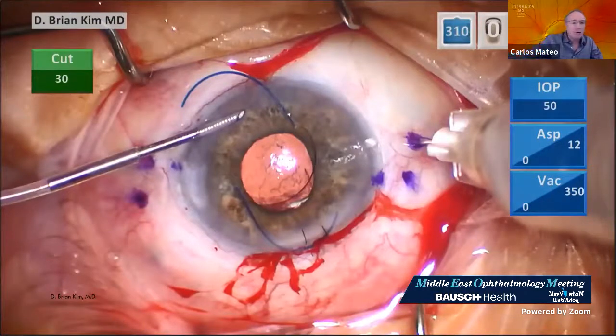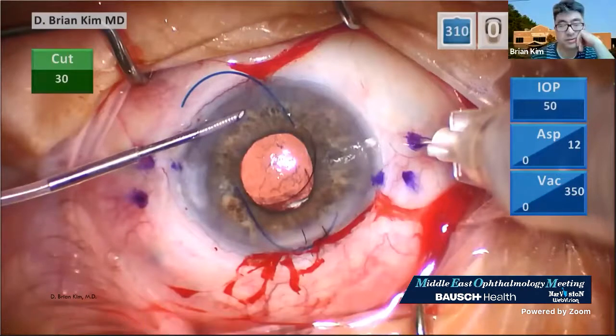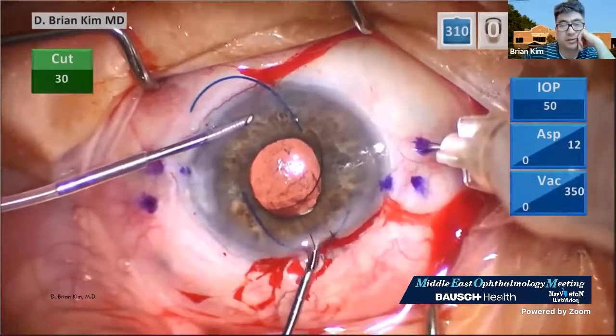Then the lens is perfect. The lens you use is this Lucia, right? Yes. Yeah, this is perfect. Absolutely perfect. So let's just see how this case goes as far as being able to pass the haptic in the needle.